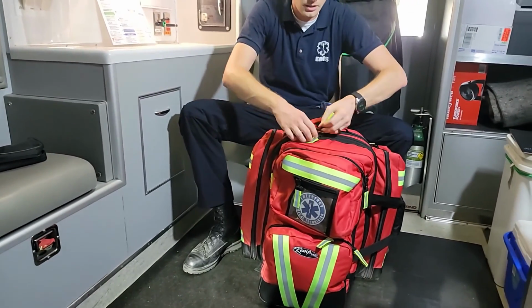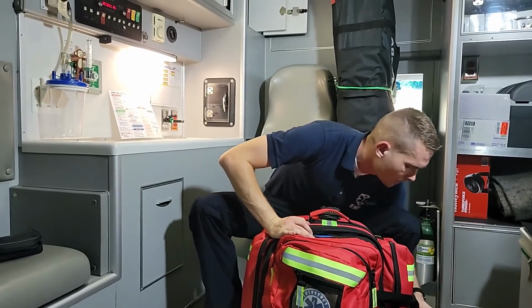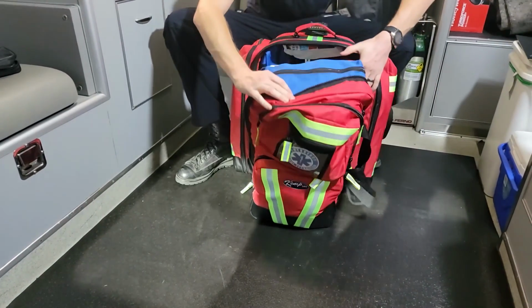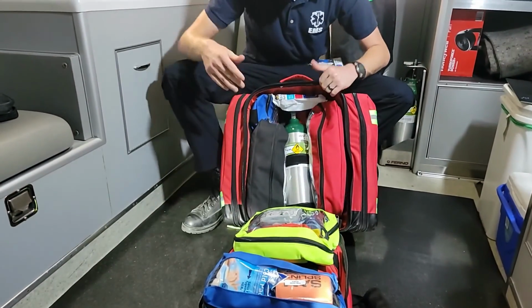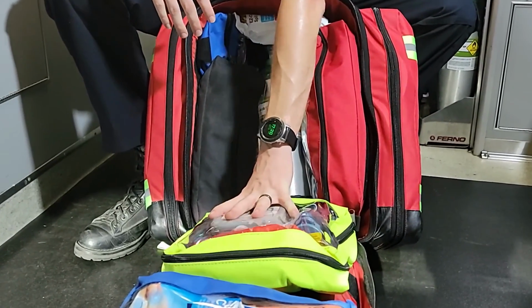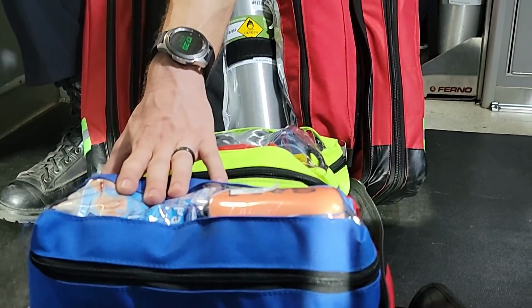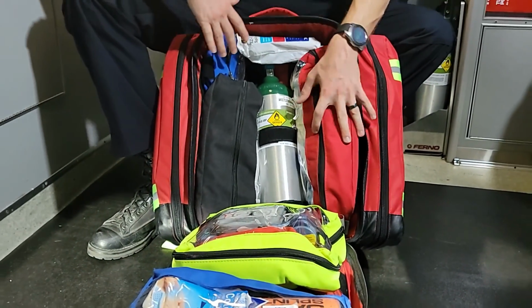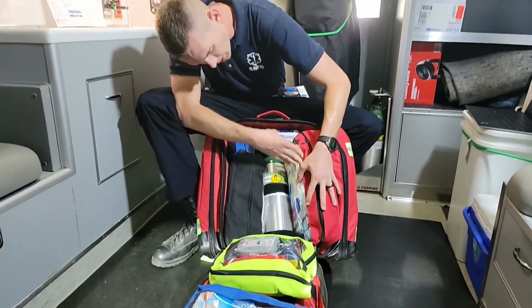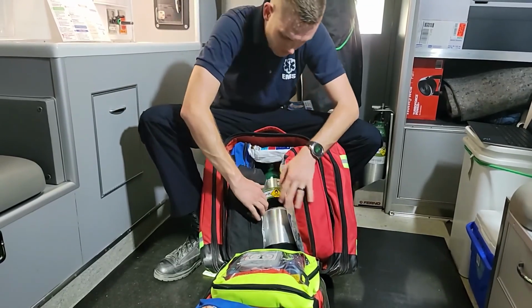So inside the pack here, I'm just going to open it up. It's got a carrying handle here as well if you want to carry it that way. That doesn't really work for my purposes. But, so here's what we're looking at. I've got my O2 tank. I've got my AED. These are going to be some cold packs, some splints, sports injuries, which is how I categorized it. It's going to be my major trauma. I've got a bunch of pads, gauze, anything major trauma related. It's going to go in here.